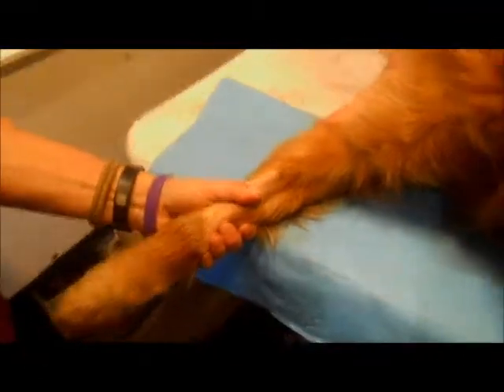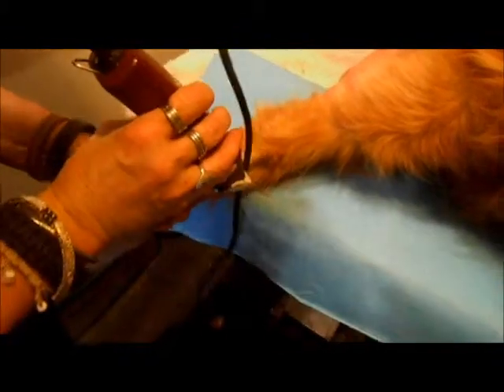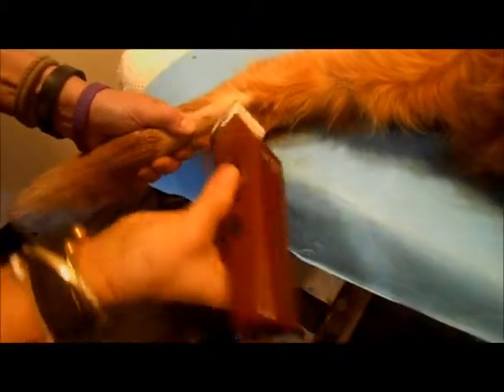Rubbing for IV catheter. Already a little shave, just finishing up to save time on the video.